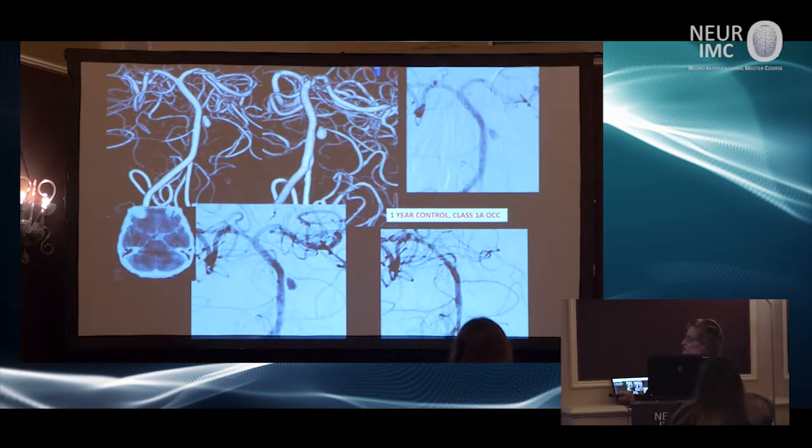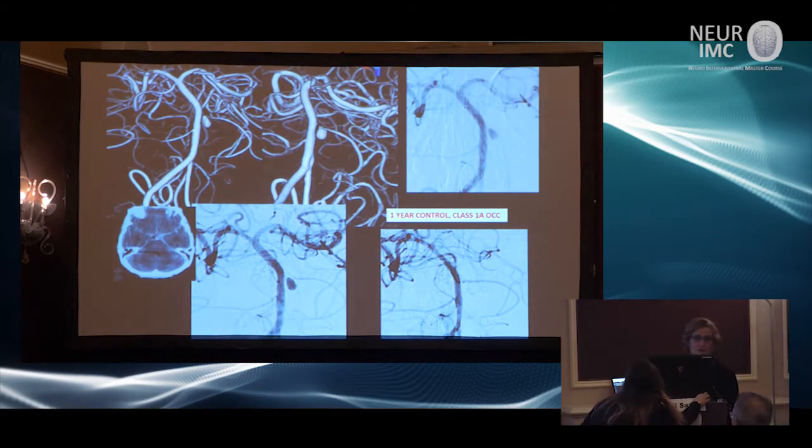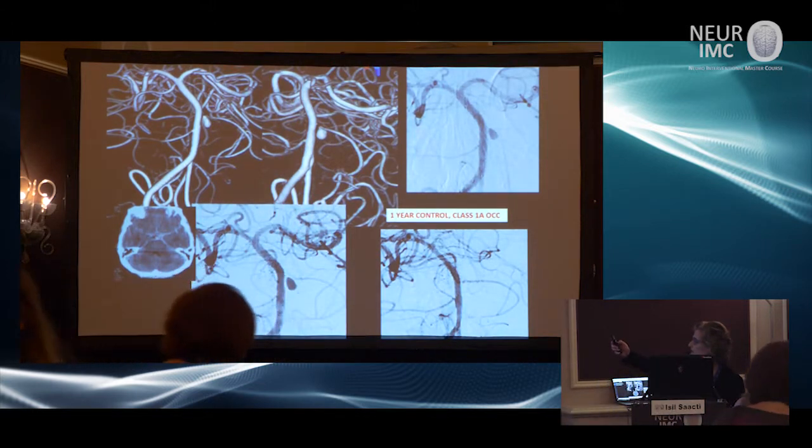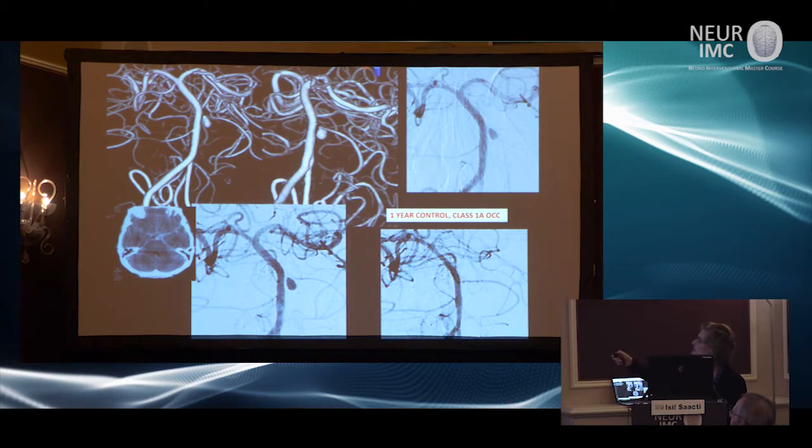And so we put actually 2 flow diverters in this case, not the pipeline though. This was 2 FREDs, and it is gone. So even though it is not sitting on the basilar artery, because the flow is decreased, it helps and it treats the aneurysm. It eliminates the aneurysm. Actually, I have another case.